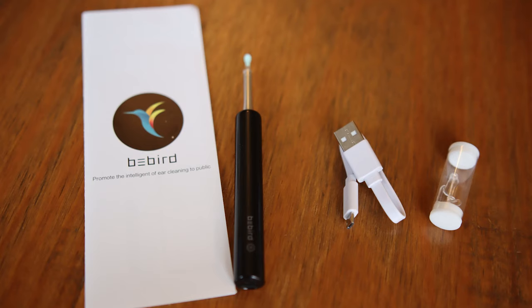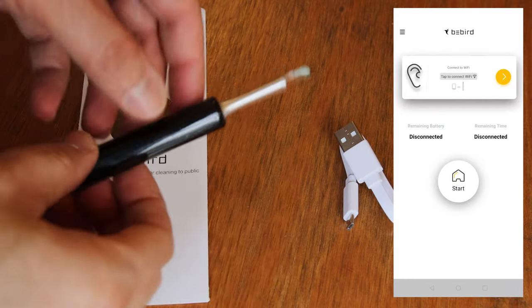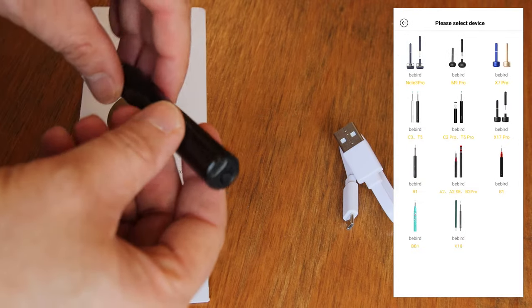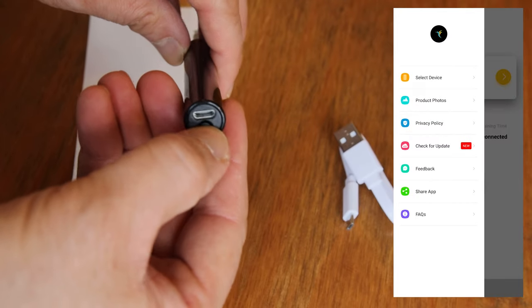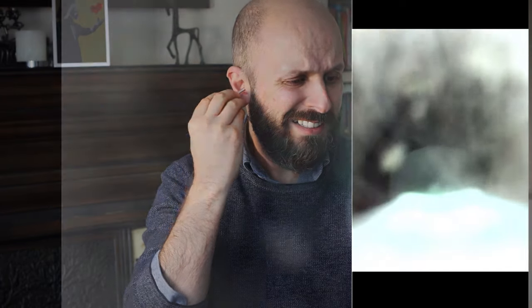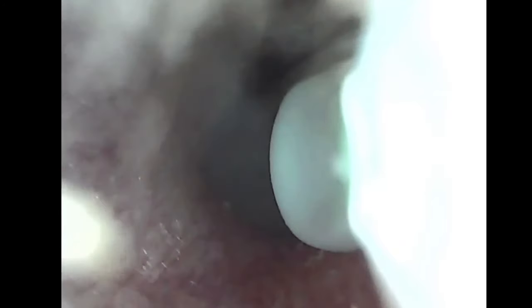Now on to the BeBird device. Essentially this is almost identical to the Viticoco — it has the same paddle, video camera, on switch, and USB charger — although the branding seems slightly more elegant, and I found the app was easier to navigate and understand. I've connected to the app here and I'm looking into my ear at the same time. To be honest, I really find it very hard to see anything — I can't see the eardrum and don't really know how deep I'm going. I finally managed to get within the ear canal and the colour looks a little grey compared to the other video, and the whole image looks slightly duller — probably because the light is reflecting off the paddle.